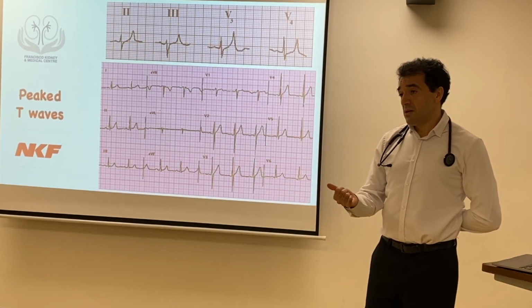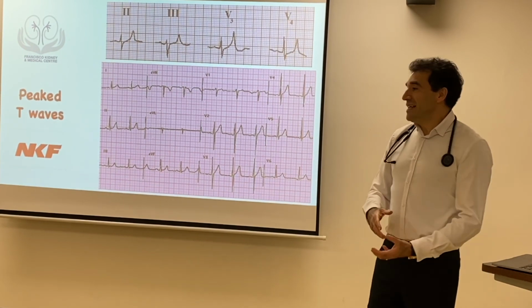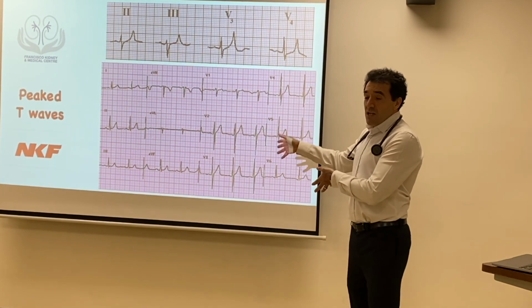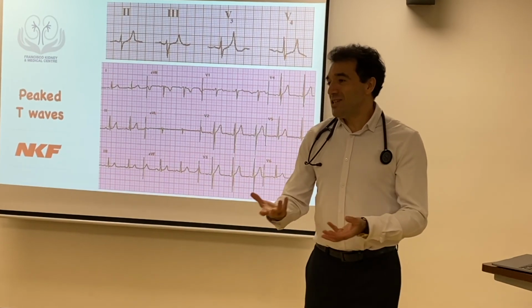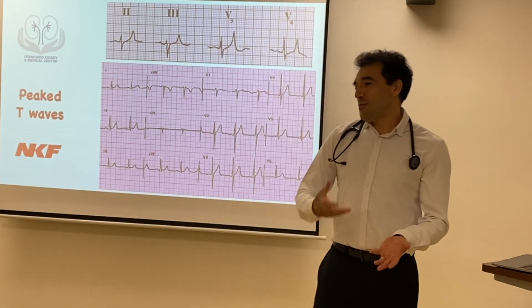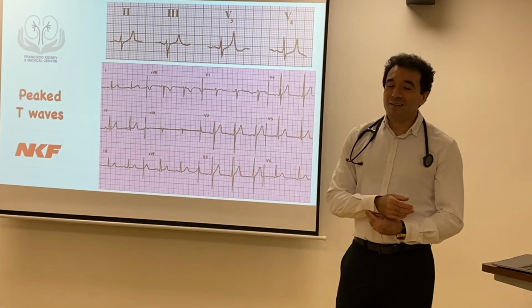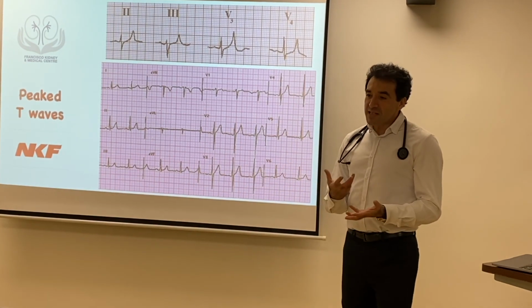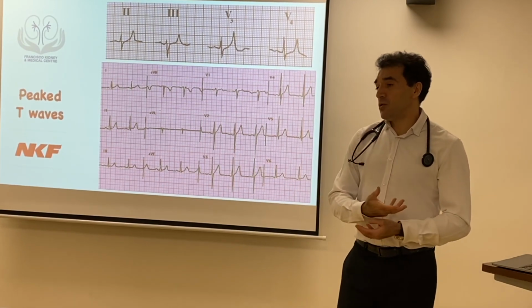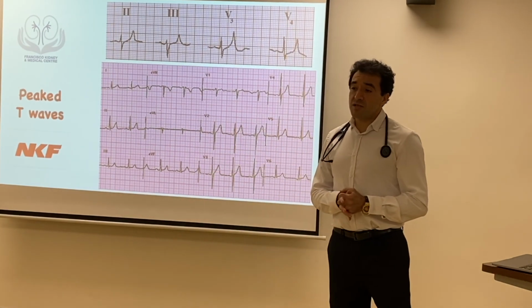Yeah, okay. So yes, probably it's not so accurate because the dialysis machine is not designed to do that. The ECG machine is designed to deal with electrical activity. It's just like a washing machine that can dry and wash and cook at the same time. So it's not going to be the best dryer, washer, and cooker. So basically, the same happens. All these features are very nice, but it won't probably be as accurate as something that is specific or designed for that. So that's just my educated guess on that.